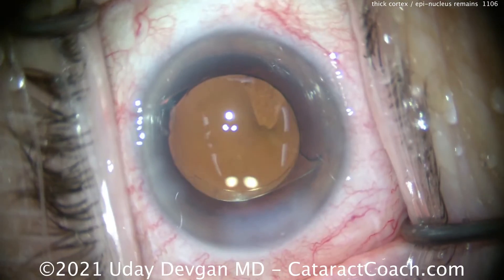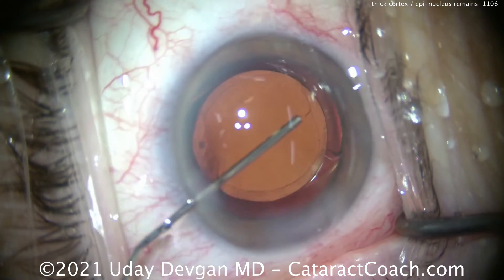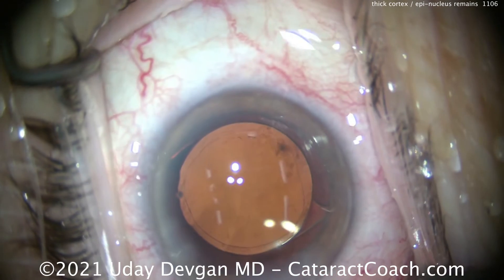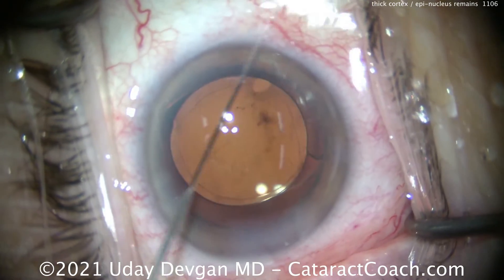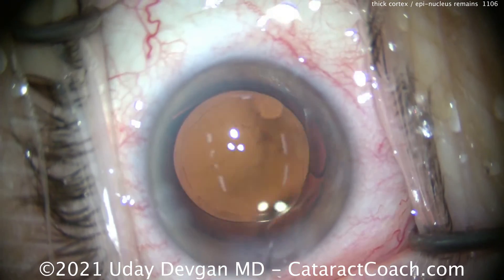Notice how we seal up the incision here at the end. Do it this way — trust me. And then the lens is centered. Nice overlap of the optic by the capsulorhexis. Beautifully centered up too. That looks great. Case is done.